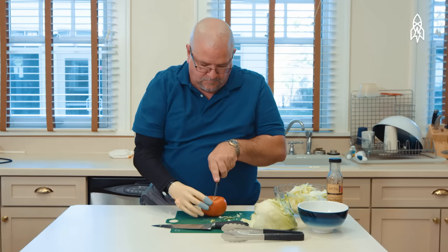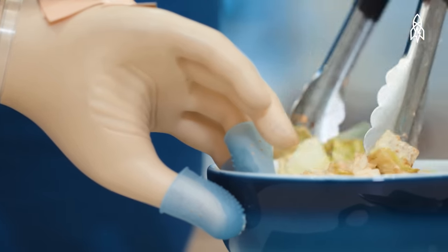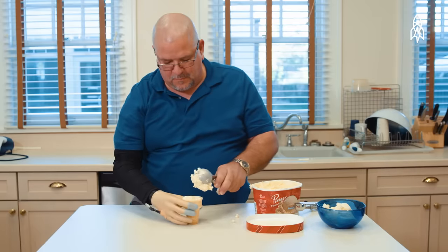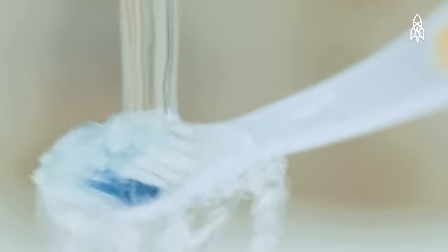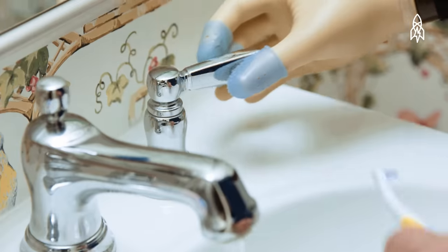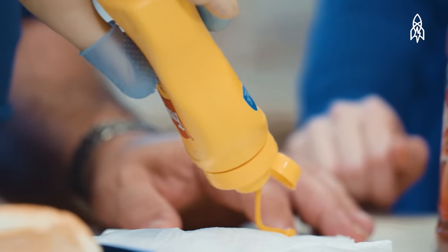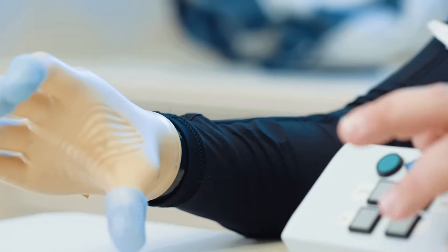Bringing the prosthetic home with the sensory hand on it and being able to feel has changed life considerably. It's just little things that people take for granted — brushing teeth, being able to hold the toothpaste and squeeze and tell how hard I'm squeezing it so I don't squeeze it everywhere. It makes it a lot easier. We're at the point where subjects can use their prosthesis at home, have sensation while they're at home. It makes them two-handed again. It brings back their hand. It makes them whole.